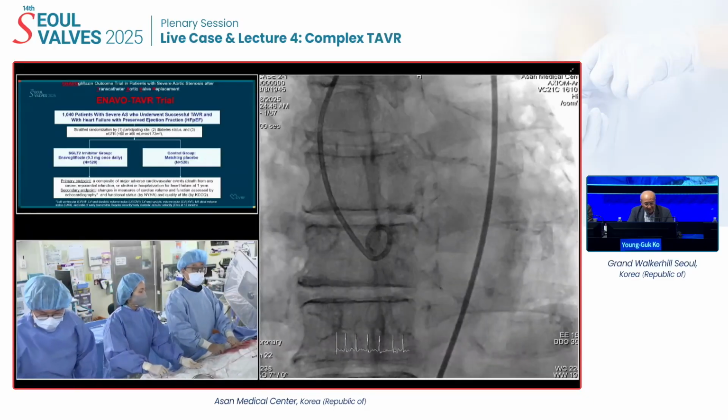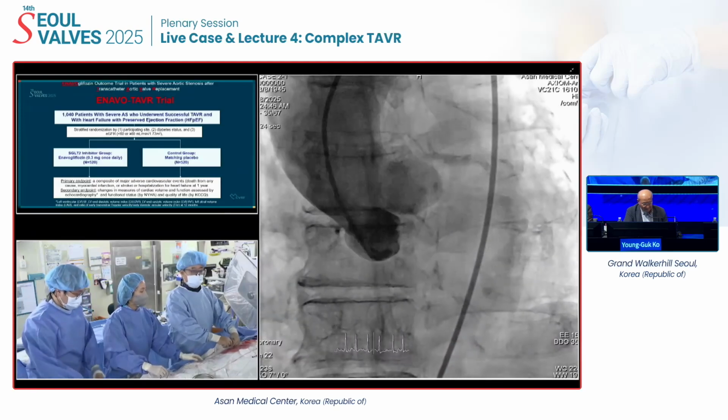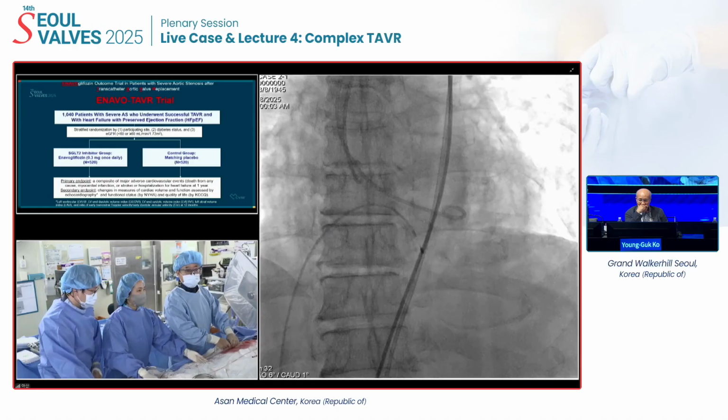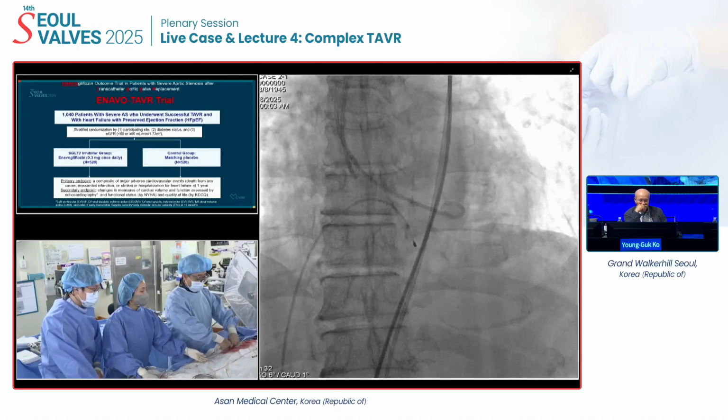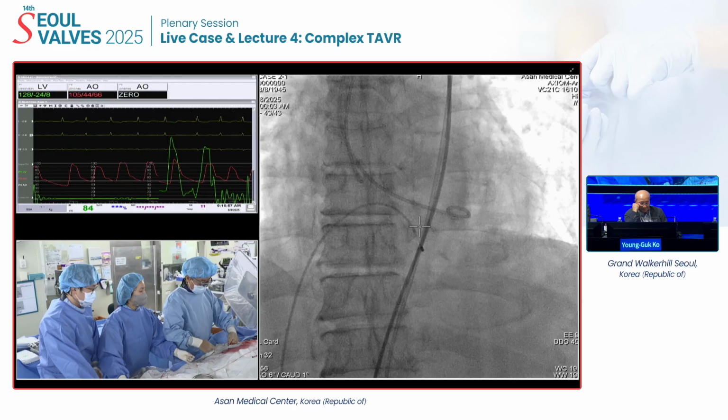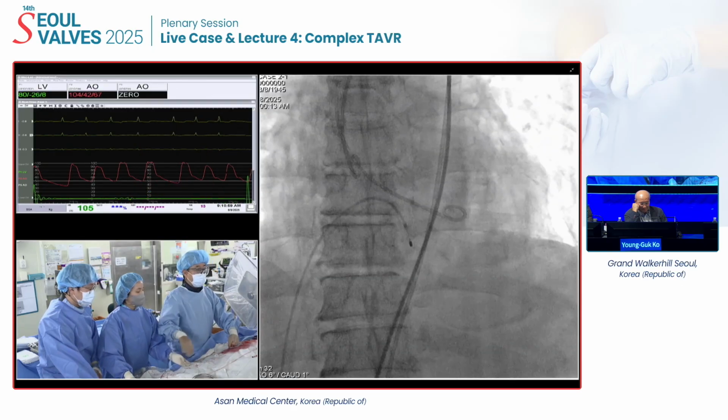Okay, yeah. So why don't you go ahead, DW. As shown in the hemodynamics, there is very severe calcium and the Vmax is more than approximately 5.0. So I'm going to use the Safari wire, usually routinely.